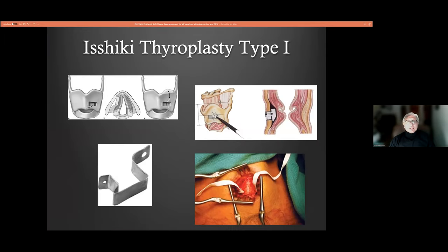Oh, so in the context of vocal fold paralysis with encroachment, this elegant operation that has been around for decades has numerous techniques. You can use Gore-Tex mesh. You can place all manner of different crafted medialization devices. But you can't do any of these if the opposite side appears to be touching the paralyzed cord.